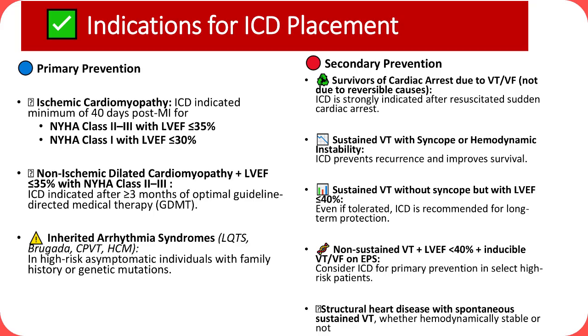For secondary prevention, ICDs are strongly indicated in survivors of cardiac arrest from VT or VF, not due to reversible causes, and those with sustained VT and hemodynamic compromise, or sustained VT without syncope but with reduced ejection fraction below 40%. Refer to AHA-ACC guidelines for updates.